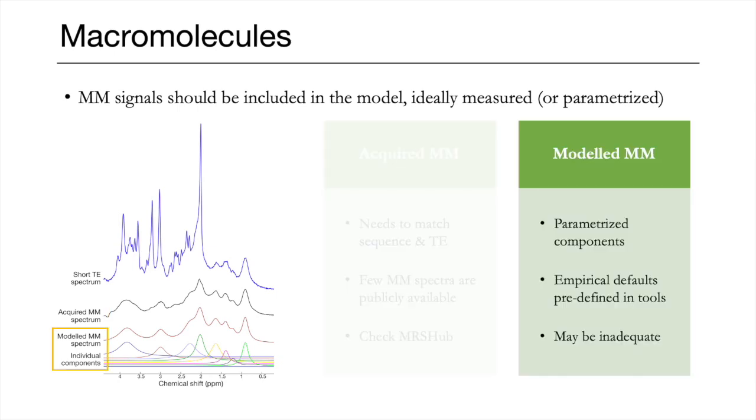Until then, the MM signals can be modeled with parametrized signals. These parameterizations are included in many software tools, but the definitions will be somewhat empirical. They may be inadequate for a given echo time or sequence, but this is all part of current research, so hopefully this is going to be addressed in the future.